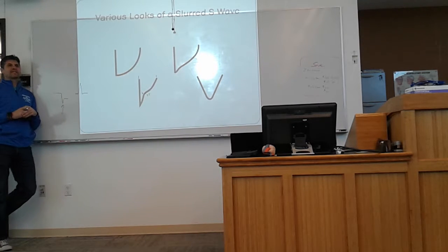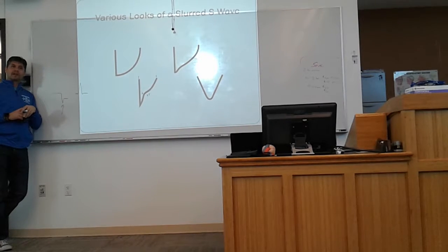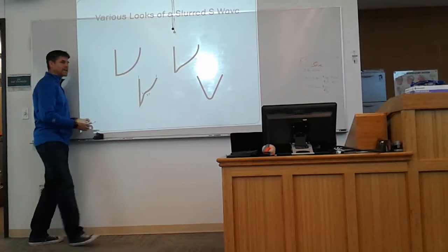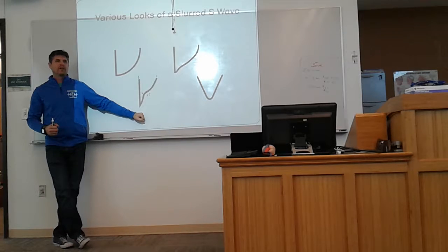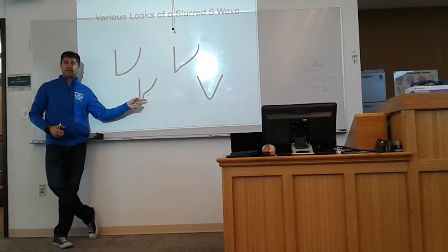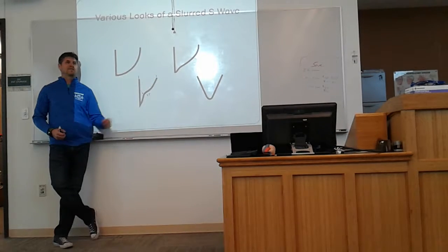You will never have reciprocal ST elevation. You can only have reciprocal ST depression. That being said, you can look in other leads, but you don't need to look in a reciprocal lead, because all you need is a lead that doesn't have a funky thing down here where you can get a clear measurement of the QRS complex. Because if I have a wide QRS complex in this lead, what is my QRS complex in every other lead? Wide. So I can just find a different QRS complex that doesn't show a funky little step right there, and I can take that measurement and then transfer it to here and go, that's where it has to end. Does that make sense?